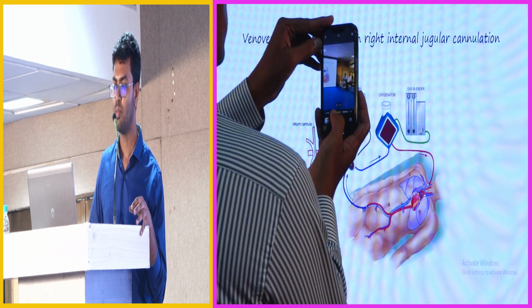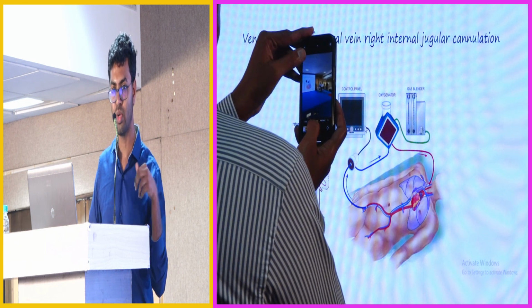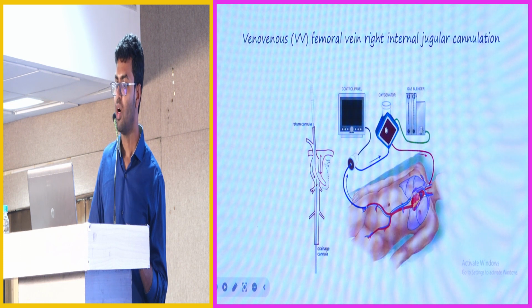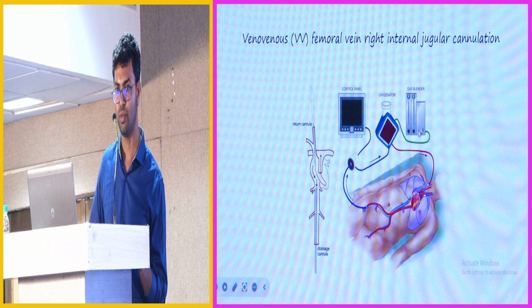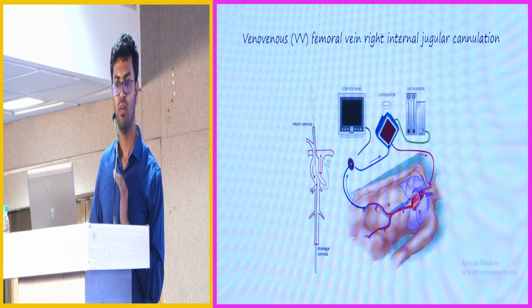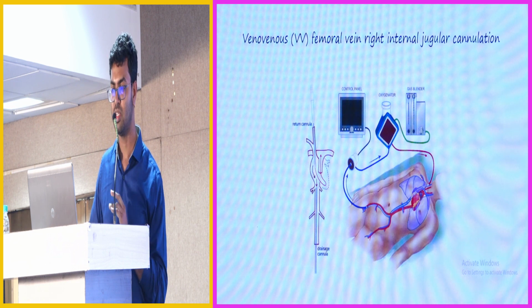This is the centrifugal pump, and it is attached to a control panel where you can control the rotation of the pump so that you can control the amount of flow it can generate. The blood is pumped to the oxygenator. This is the membrane oxygenator. It receives gas from a blender. On this blender there is a dial with which we can control the FiO2. The FiO2 range is from 0.21 to 1, that is 21%, room air, to 100% oxygen.